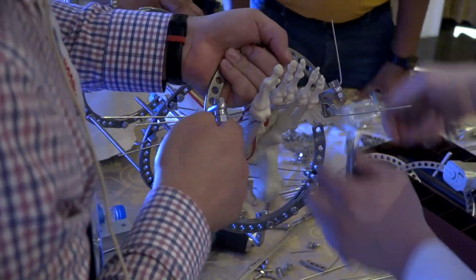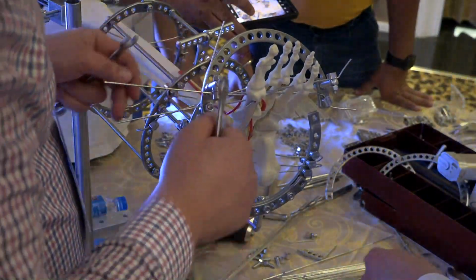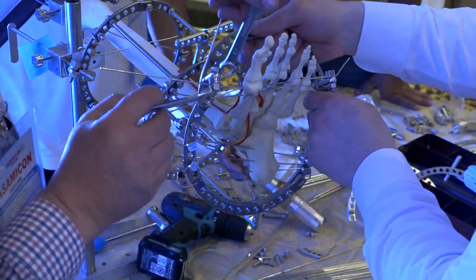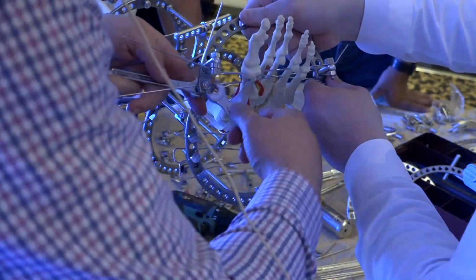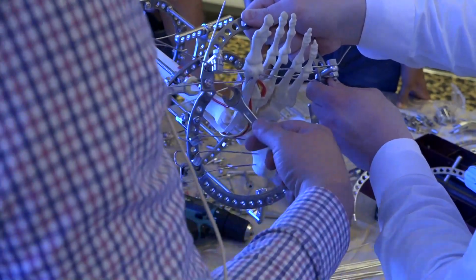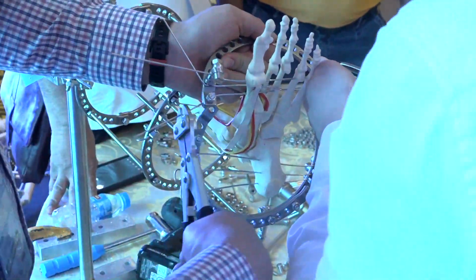Will you apply tension one more time in these wires? We're trying to get first, second, third metatarsal. Now, are you going to apply tension or not? We usually use the Russian technique for tension. You are applying tension, no? No, only by hand. You don't want to tension? Yeah, we don't use it, because it takes a lot of time. I mean, you are applying the wire tensioning technique, no? Yeah, especially that technique. And finally, it does not take a lot of time.